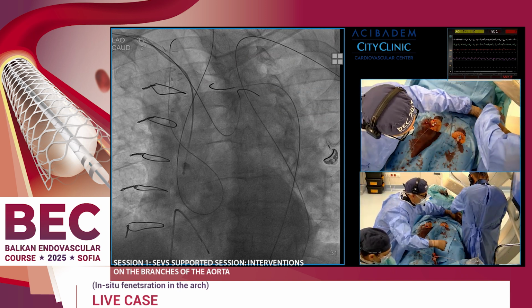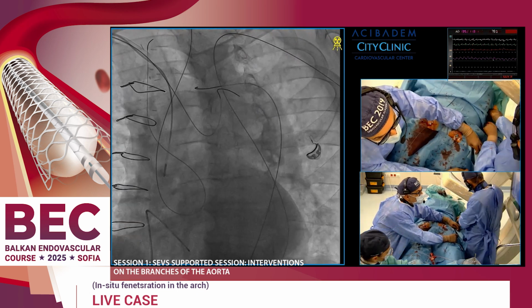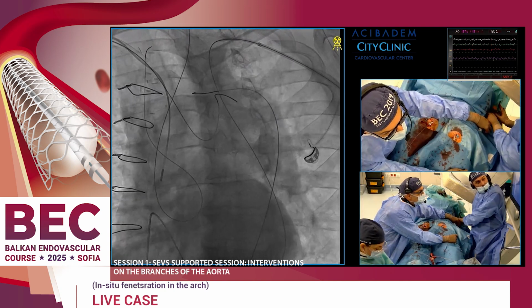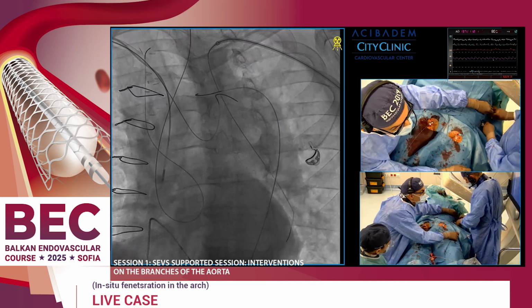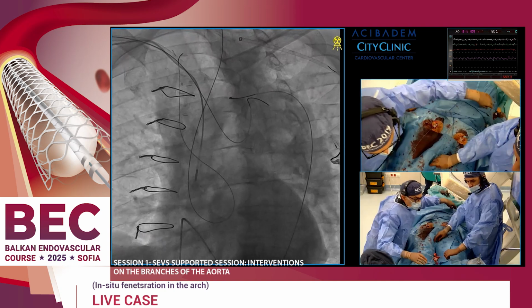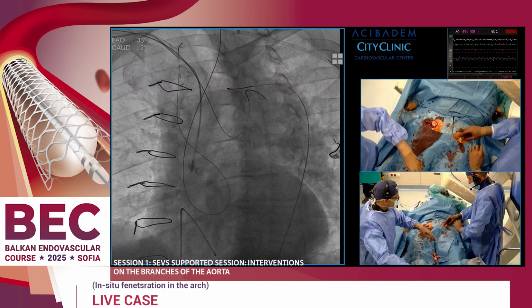At the injection, it looked like you have a kink at the distal anastomosis of the ascending aortic arch between the graft on the ascending aorta and the arch. Absolutely. You are right. And because of that, we are going to position a Lunderquist wire. That is our usual approach for the implantation of the aortic graft and under rapid pacing.